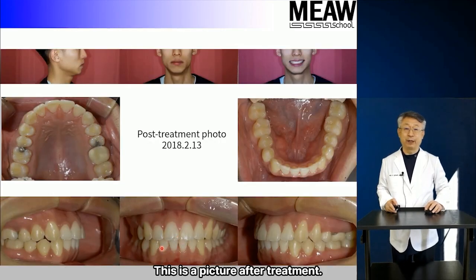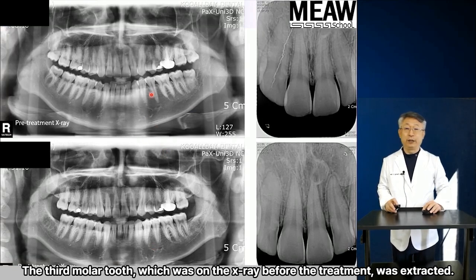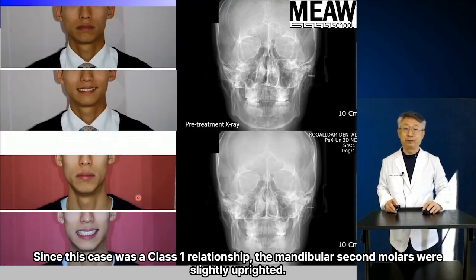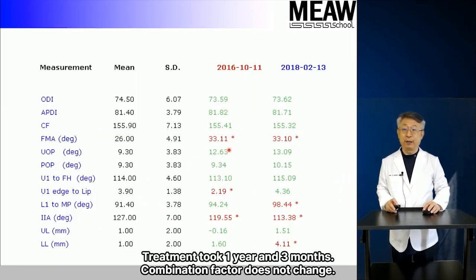This is a picture after treatment. The anterior crowding has been resolved and the maxillary and mandibular arches are slightly expanded. The third molar tooth, which was on the X-ray before the treatment, was extracted. Since this case was a class 1 relationship, the mandibular second molars were slightly uprighted. The front and lateral views of the face have not changed significantly, and the smile has become more natural. Treatment took 1 year and 3 months.